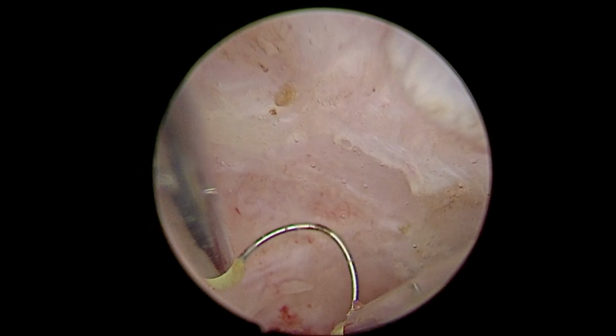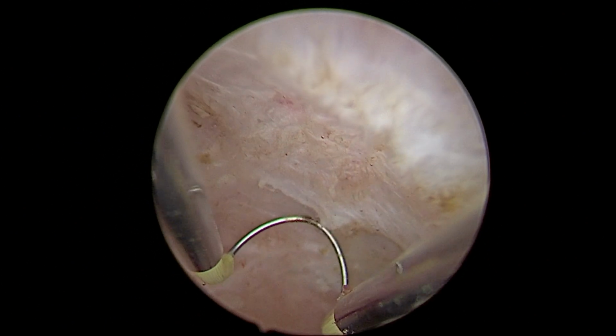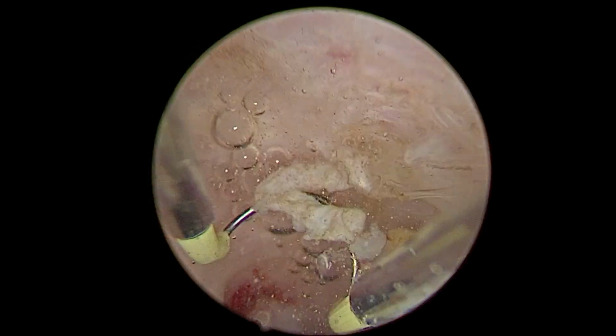So you can keep watching the video and I will keep mentioning the key points in hysteroscopic correction of isthmocele as and when required.